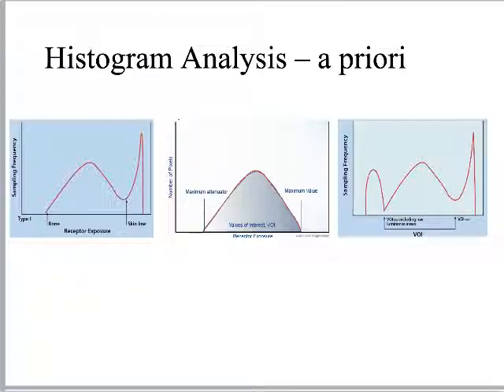The reason I'm burning so much time talking about this is because if I shot a chest x-ray, but I told the computer it was a hand x-ray, that's a problem. Because I'm thinking it's going to give me model A, but I just told the computer give me model C. So the same issues would be in effect. All of the contrast is going to be off. The area that it selects for the volume of interest could be off. A number of things will wind up looking funny about that picture.